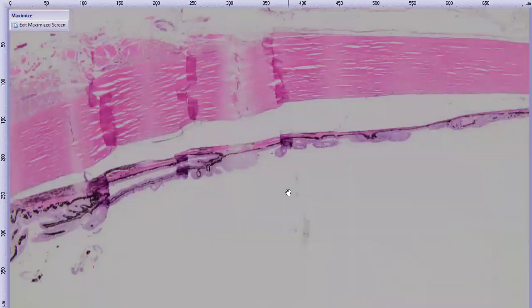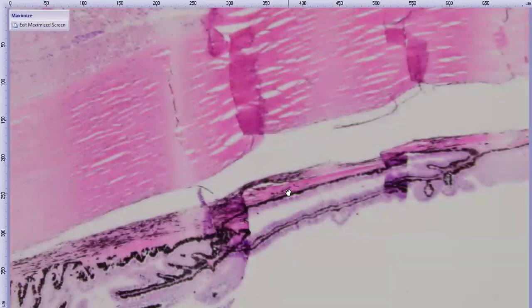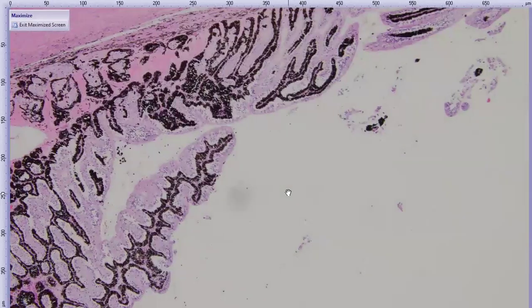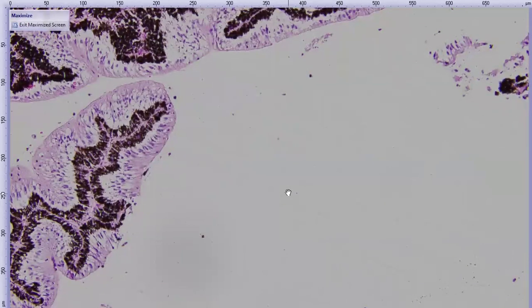Another thing I wanted to show before we move on is the ciliary body. You guys remember on that picture that there was that white material over the ciliary body surface? This is not the best example of it, but again, let's turn our imaginoscopes on.